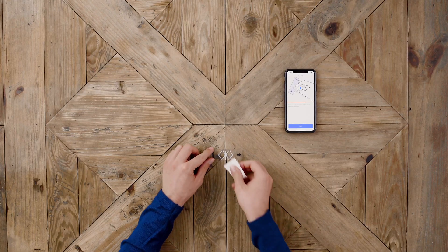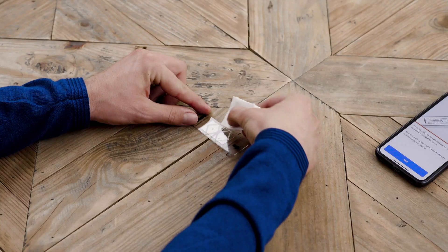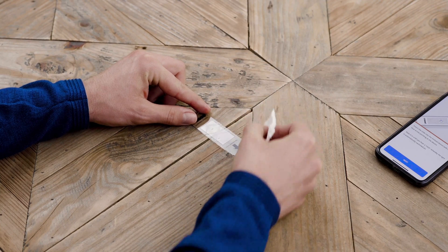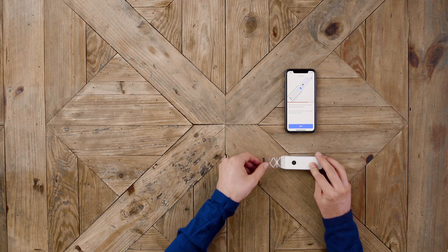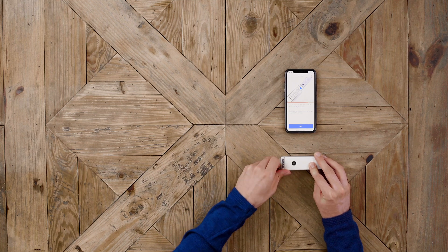Gently clean the glass slide with the wipe to remove any remaining liquid on the side of the slide, as shown. Then insert the slide into the exceed device until the light is switched on.